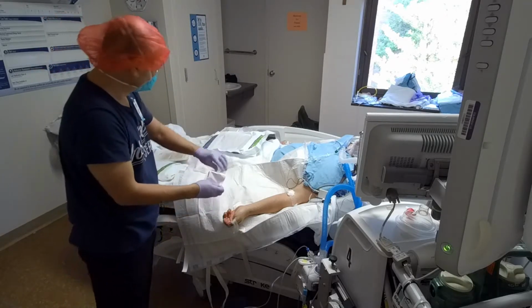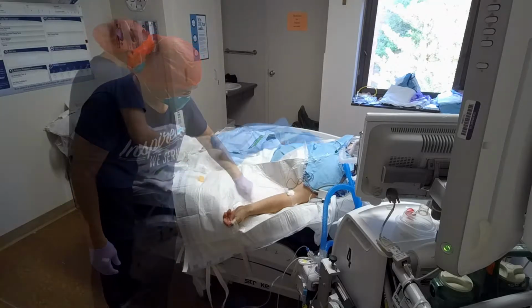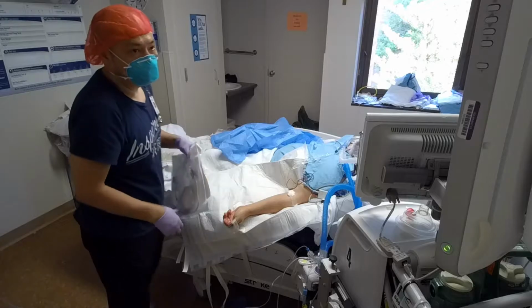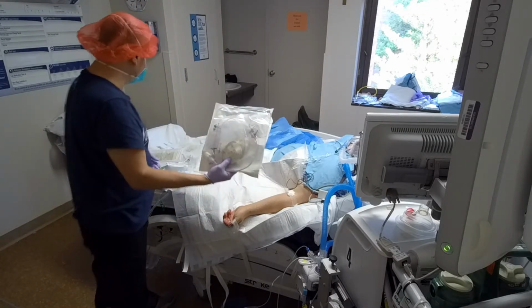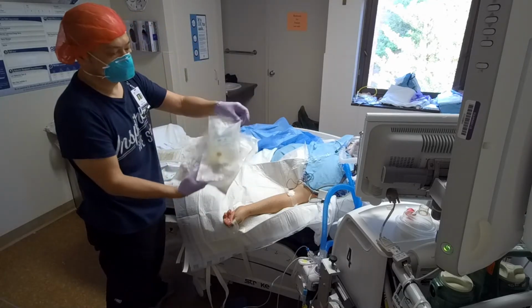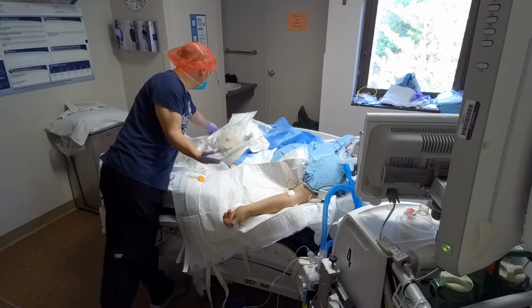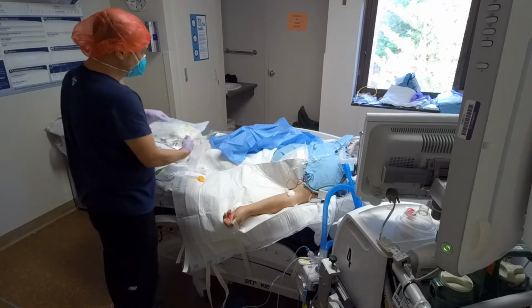The next thing you're gonna do is clean it with some chlorhexidine for 30 seconds. So, before we even start the A-line, what you need is the tubing, some normal saline, and a pressure bag, okay? So let's start that.